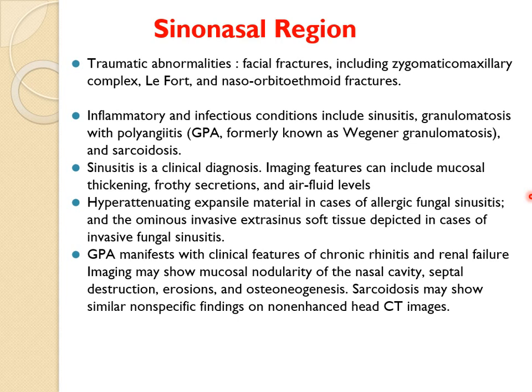Any hyperattenuating expansile material is seen in allergic fungal sinusitis, which occurs mostly in asthmatic patients. And ominous invasive extrasinus soft tissue is seen in invasive fungal sinusitis. Granulomatous polyangiitis manifests as chronic rhinitis and renal failure.